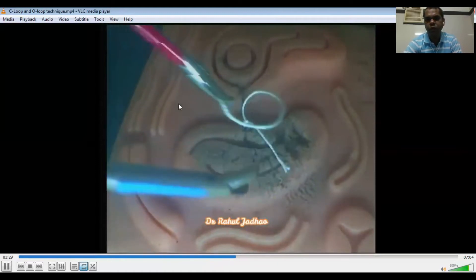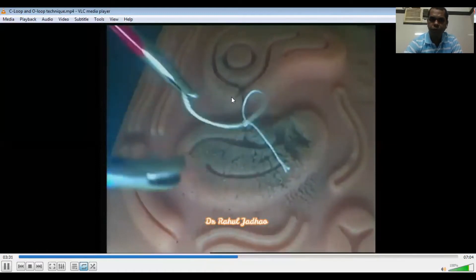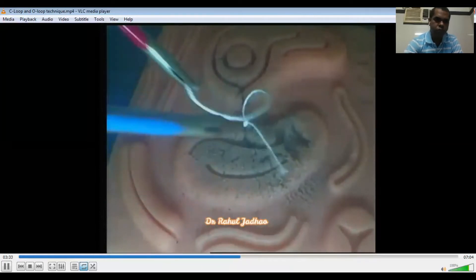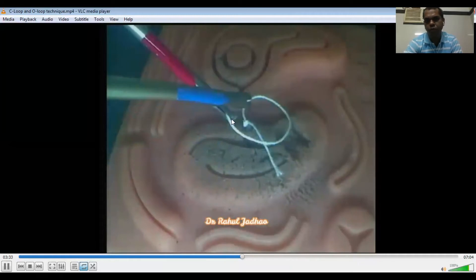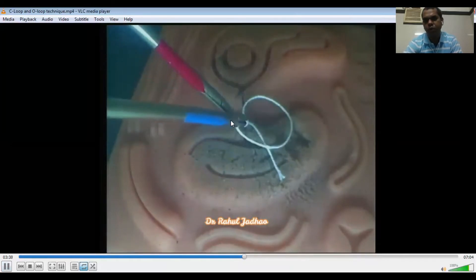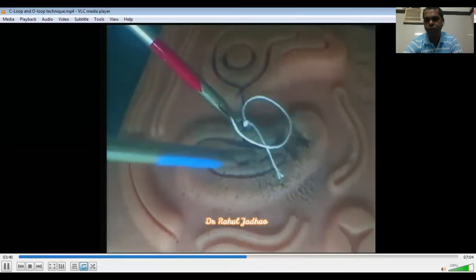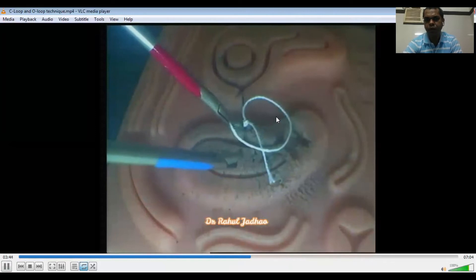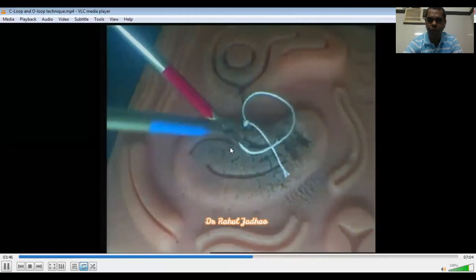The long tail is held with the left needle holder, and this is the O-loop. We have to bring the tip of this left needle holder near the target. This is the O, and now this left needle holder is pronated.